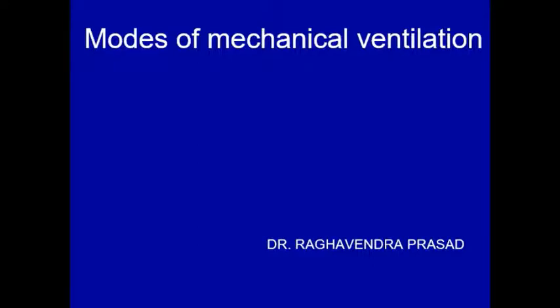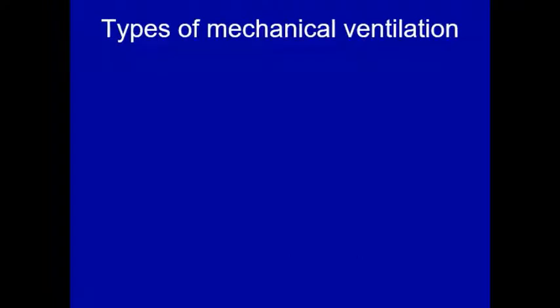So today we shall learn about the modes of mechanical ventilation. So the types of mechanical ventilation. So here we have got negative pressure ventilation. Negative pressure ventilation was used in the olden days and nowadays it is not used.